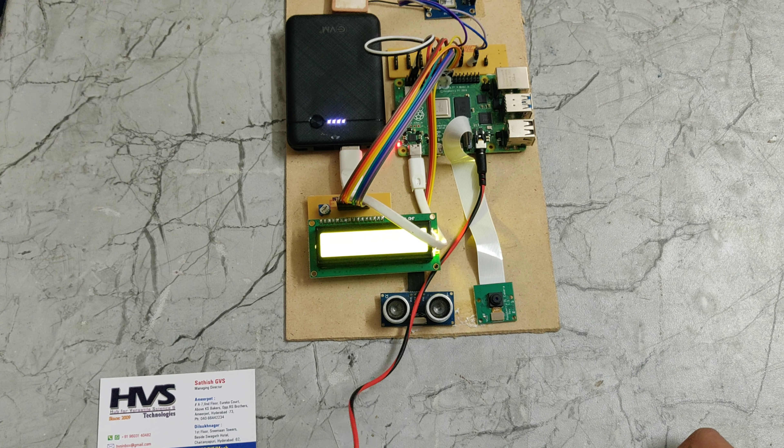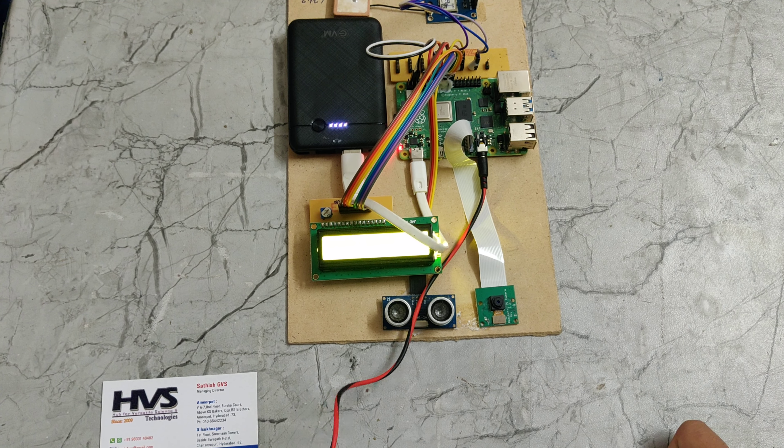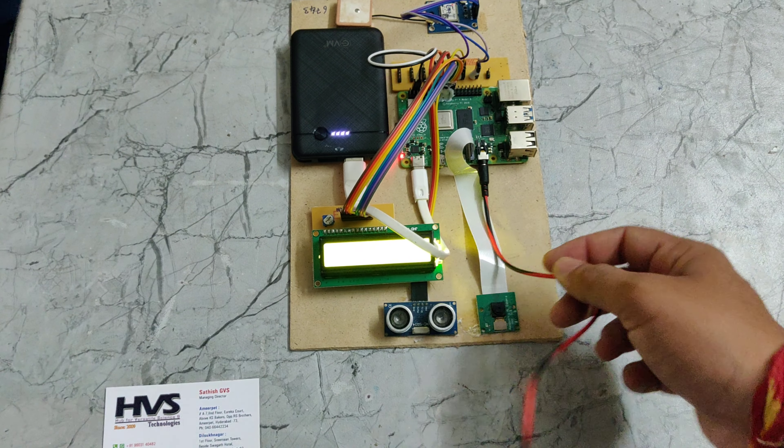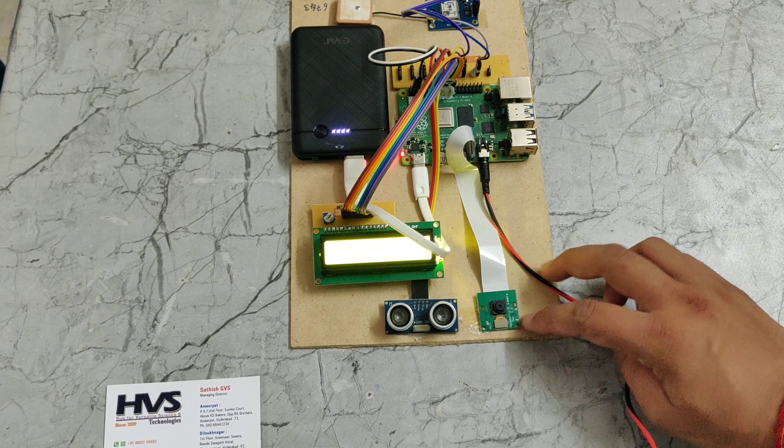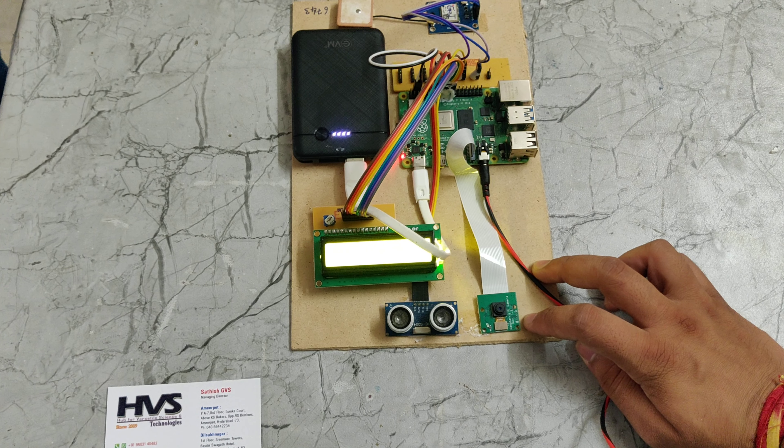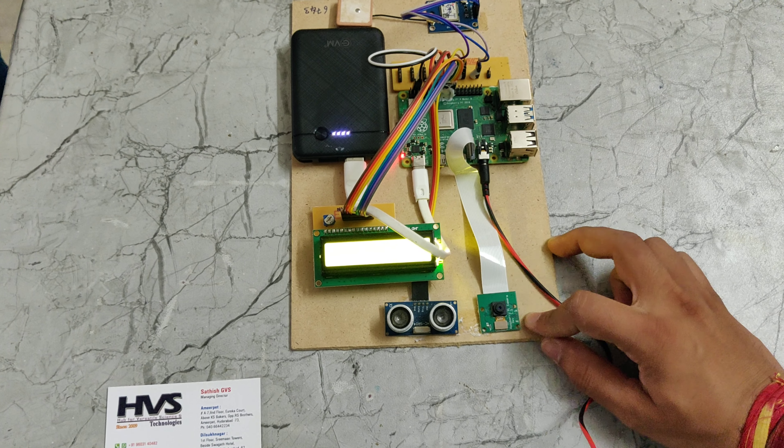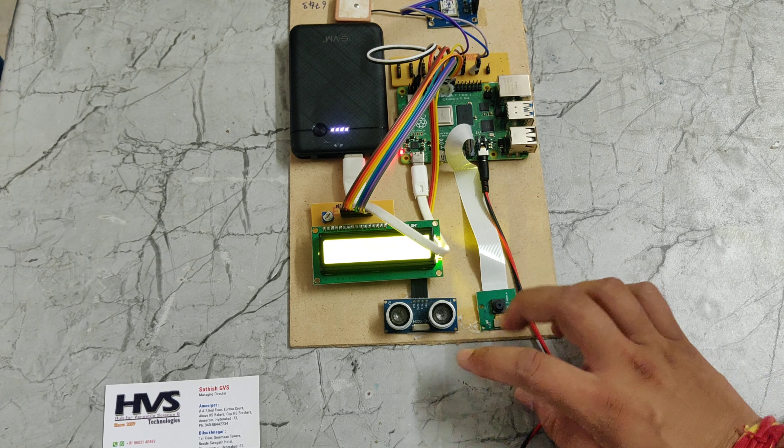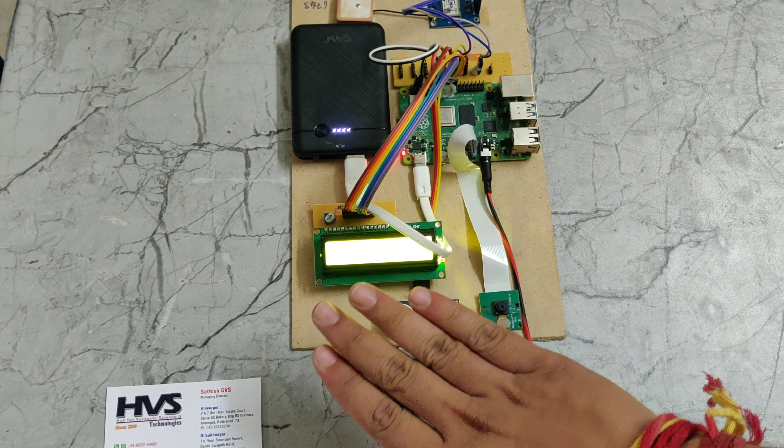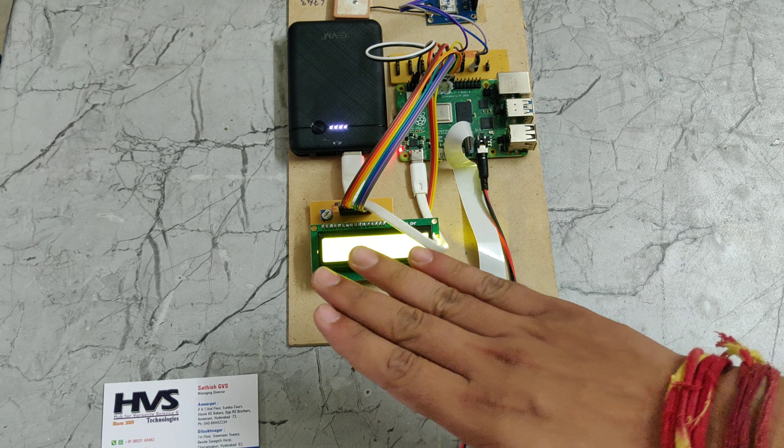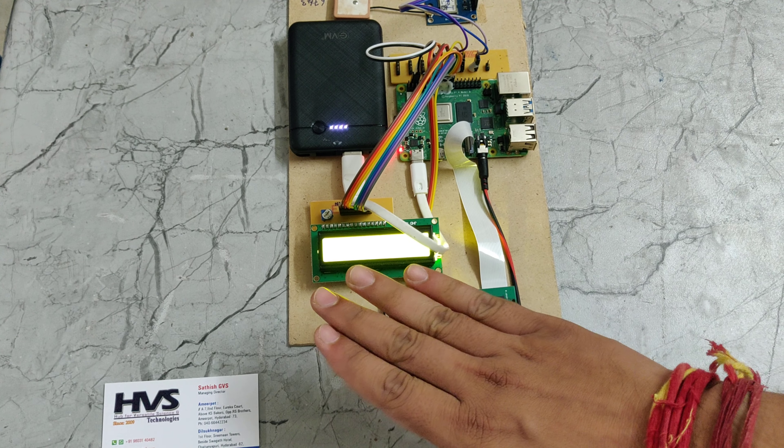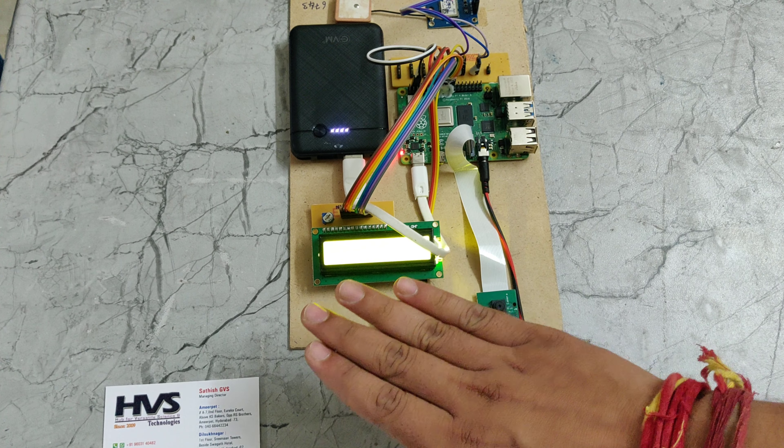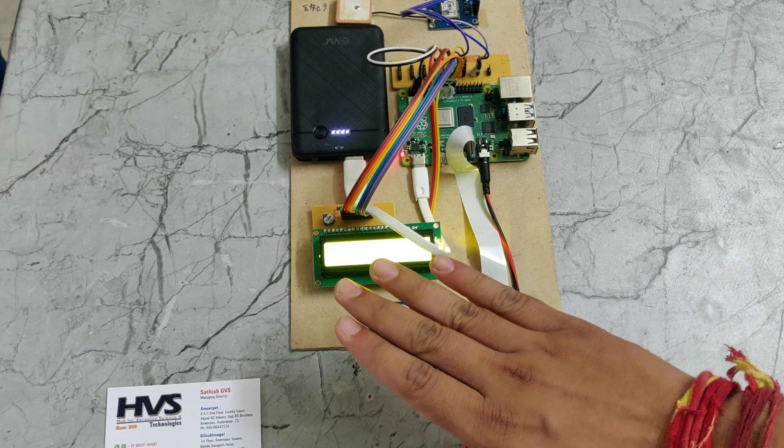Now it is detecting me, so that's why it is showing as person detected. And also we can see if the ultrasonic sensor detects an object, it will show as object is too close.